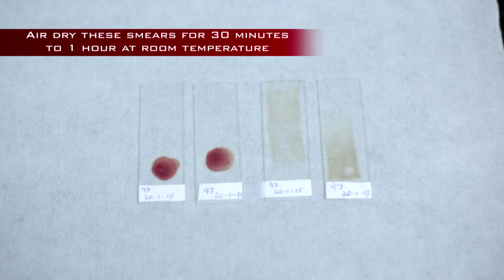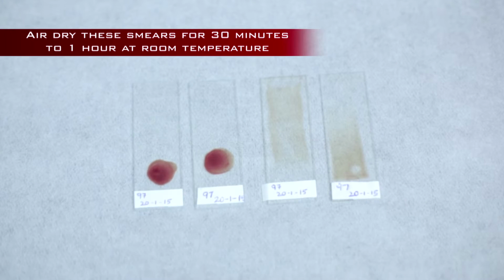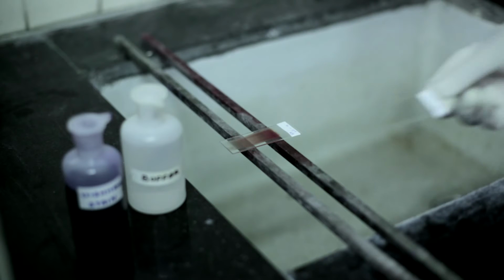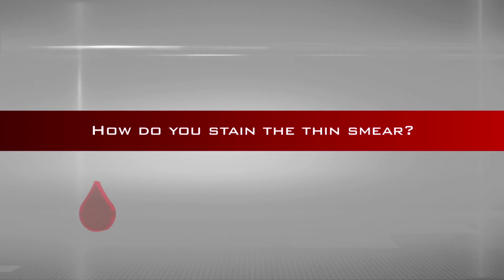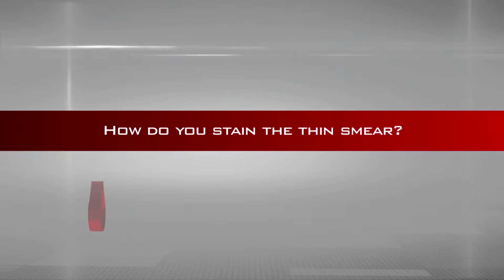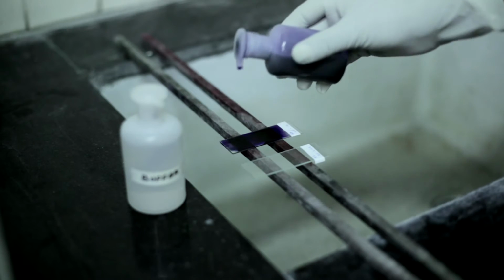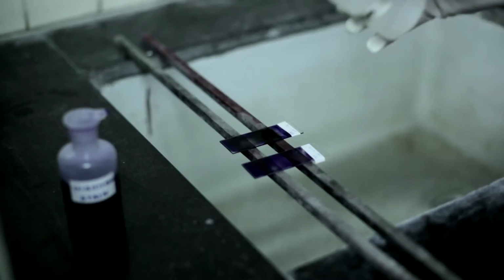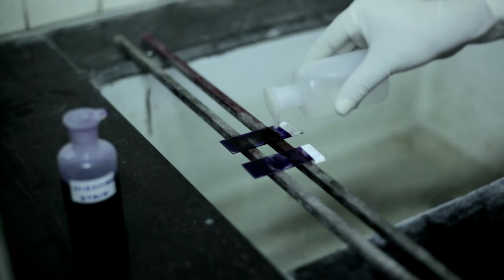Air dry these smears for 30 minutes to 1 hour at room temperature. Now, both the smears are ready for staining. How do you stain the thin smear? The thin smear is stained by flooding the smear with Leishman's stain and leaving it for 2 minutes to fix. Now, add twice the amount of phosphate buffer.